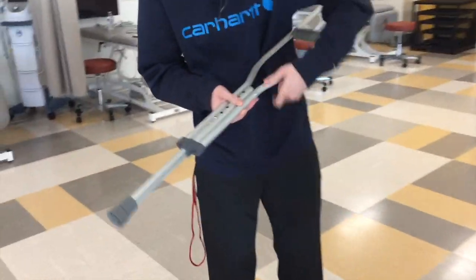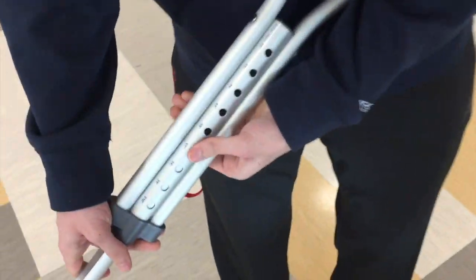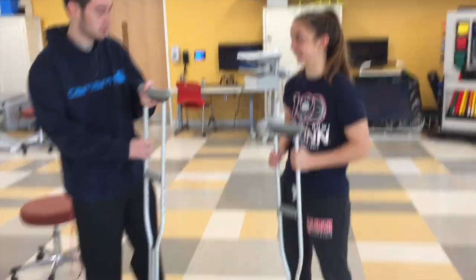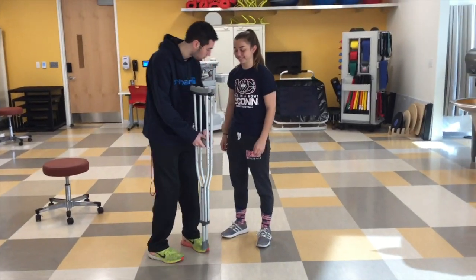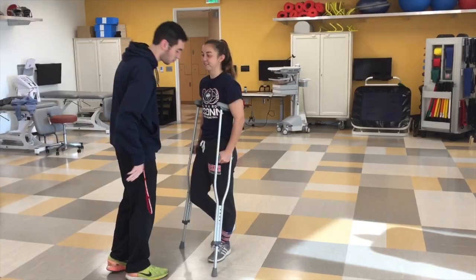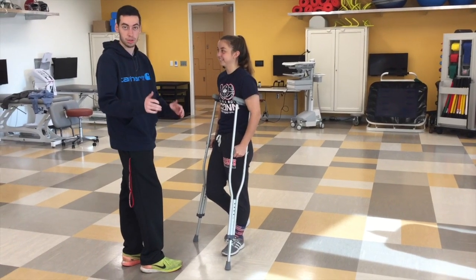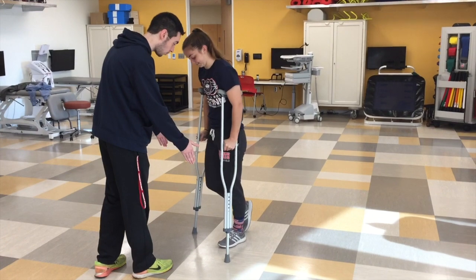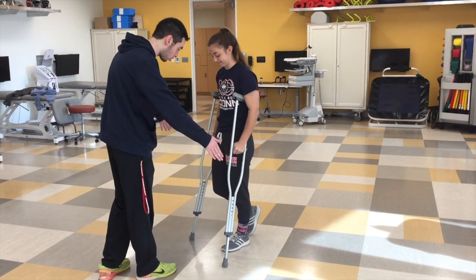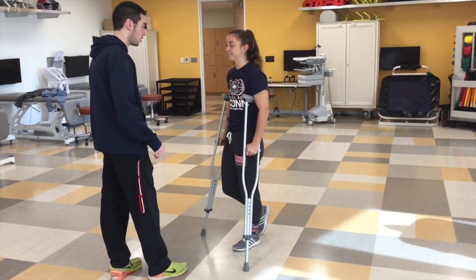Let me check this one — make sure they're both the same height. Oh, 5'7". We need to change this one. There we go. And then make sure these handles — we're gonna have you hold it here. Actually first, what we have to do is make sure it's in the right position. Put it two inches in front of you and six inches to the side. There we go.